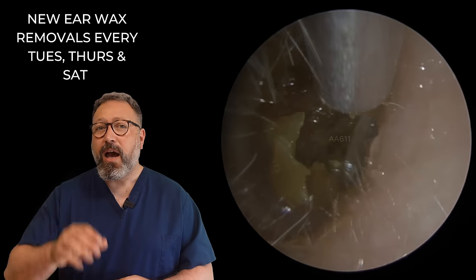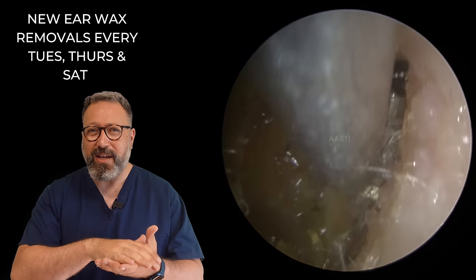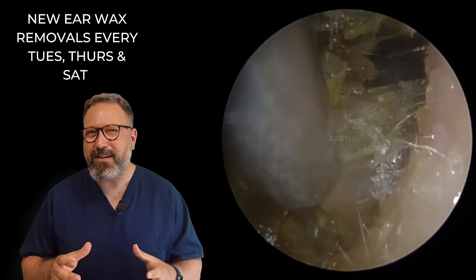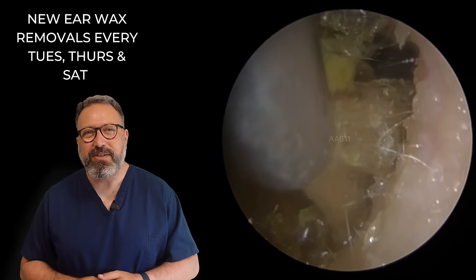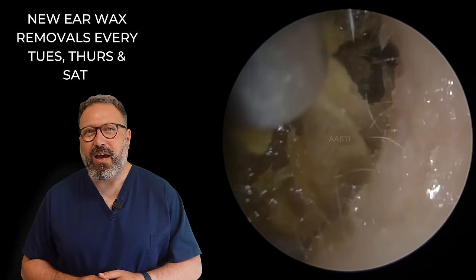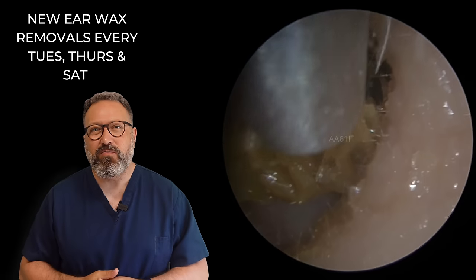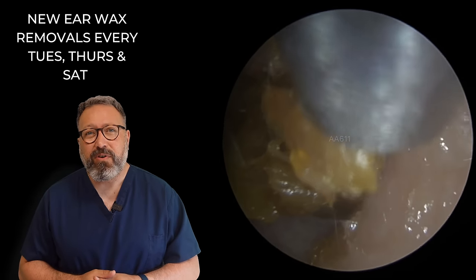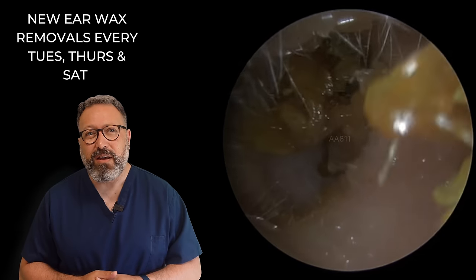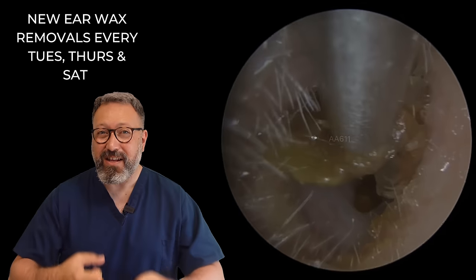I've put a little bit of olive oil in — two reasons really. First, because it's a little bit stickier underneath, so it's going to help stop it from re-sticking. But the other thing is oil tends to loosen everything up a little bit in the ear canal, making it just a little bit easier to pull this out. We've got a good grip on this little bit of dry skin on one side, so I'm just working that out, because a lot of this drier wax material will have dried around some of these skin layers, meaning it's going to hold everything in really, really tightly. We've managed to break a little bit — there we go — just starting to come away. You can see that top section pulling forwards. You can see how it flicked back as it broke away, so it's really held in there very, very tightly.